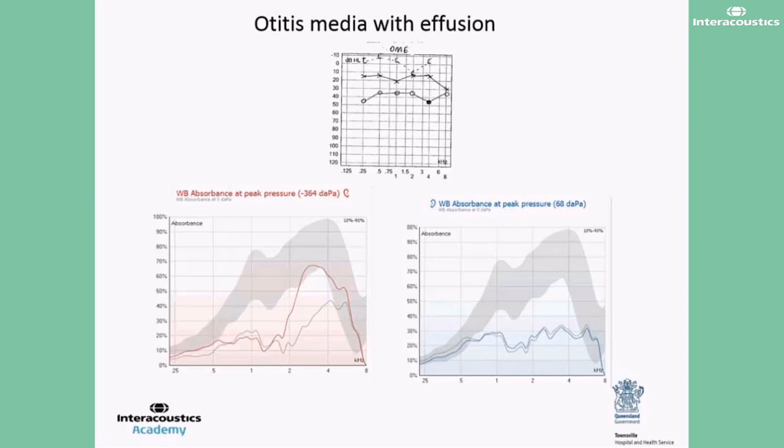These two wideband absorbance traces are taken from the ears of a 6-year-old child with bilateral otitis media with effusion. Each ear demonstrates a different pattern. The absorbance is reduced equally across the entire frequency range in the left ear, while the absorbance is reduced with a peak in the high frequencies in the right ear. The difference in the absorbance pattern can be attributed to differences in the content, amount, and viscosity of the effusion.